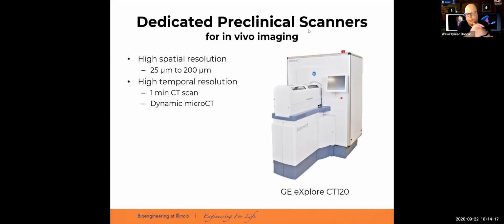The higher number, the spatial resolution of 200 microns, shows what is the poorest resolution. All those systems have their own protocols, or parameters that you can change. If you are interested in very fast acquisition, which will take quick time but also will not require a lot of data to acquire, of course there will be a compromise, and the compromise will be with the spatial resolution.